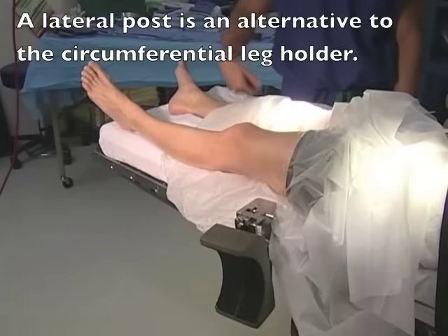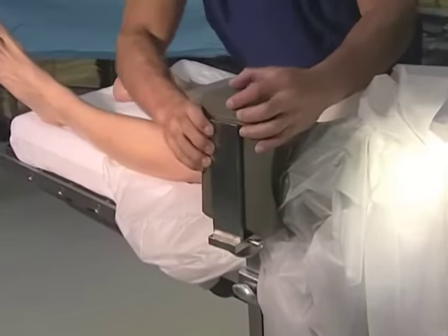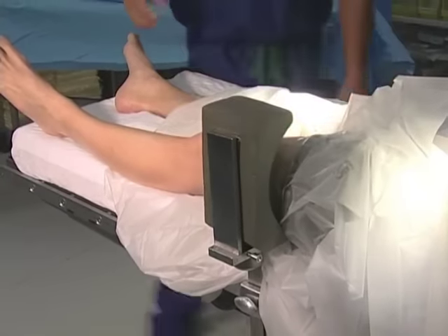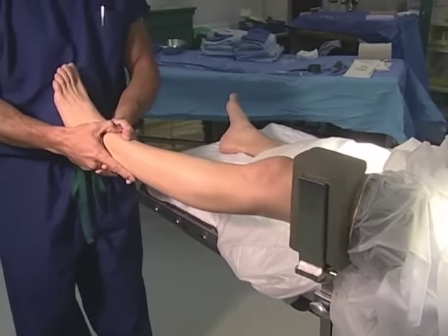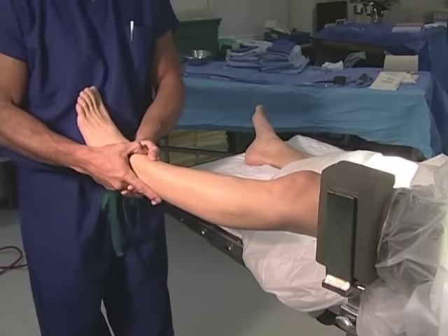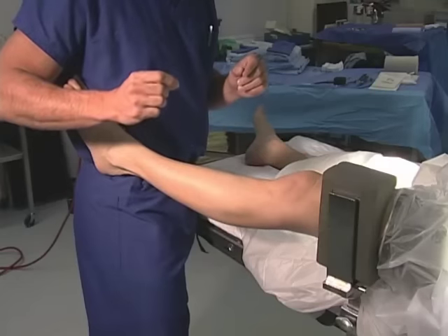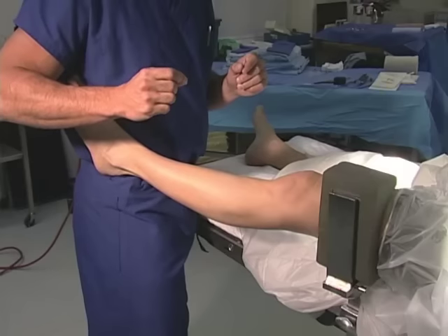The lateral post is locked into position. The post allows the surgeon or assistant to grasp the foot and push it into valgus or laterally to expose the medial compartment. If a surgeon is working without an assistant, he can place the leg on his hip and use his hip to push the leg laterally or into valgus while using his hands to operate the camera and instruments in the medial compartment.